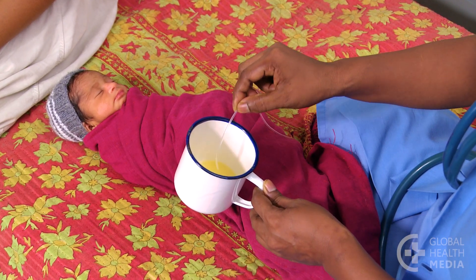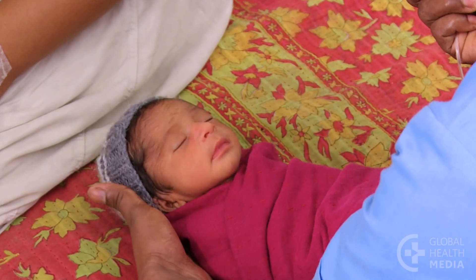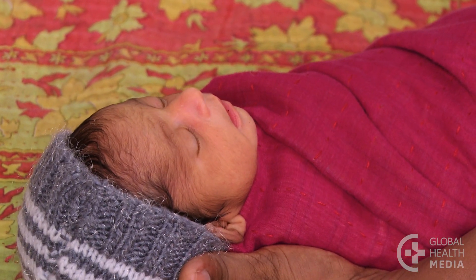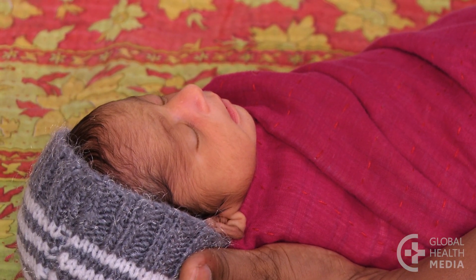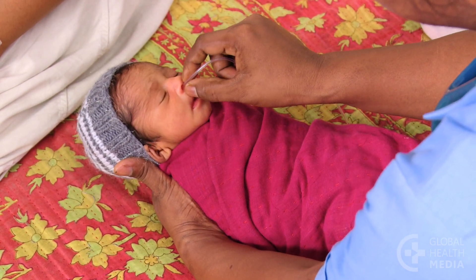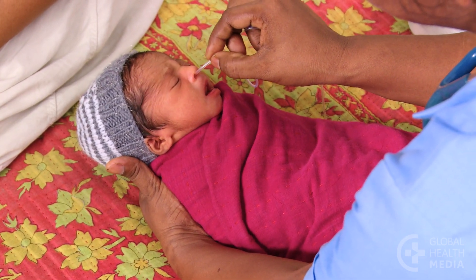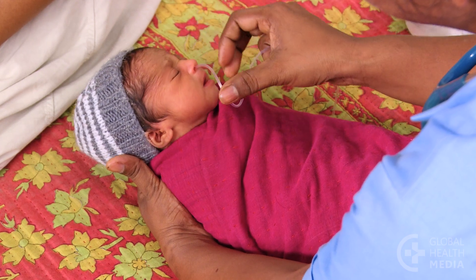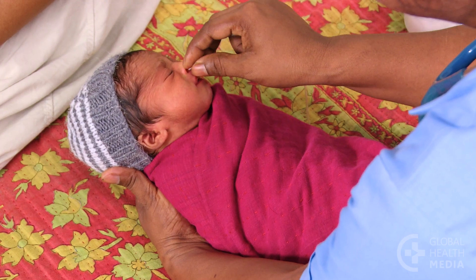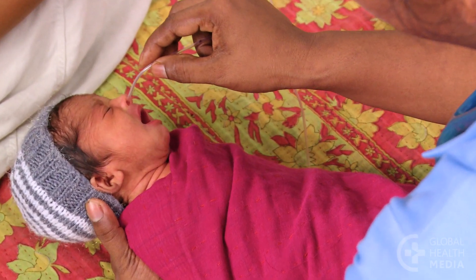Lubricate the tip with expressed milk to ease the passage of the tube. Hold the baby's head still and flex the neck forward slightly. Gently insert the tube through the baby's nostril slowly and steadily, aiming to the back of the head, until you've reached your mark. The tube is uncomfortable for the baby as it's inserted but painless once it's in place.